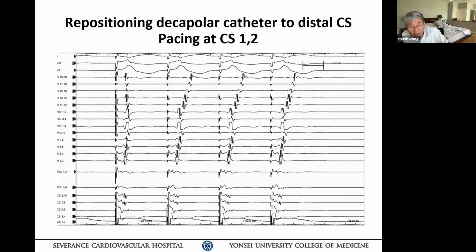But if you put your pacing catheter down to the cardiac vein, as you mentioned, it is epicardial. So I think that should favor pathway conduction. I shouldn't see any concern there because you're not going to alter the outcome or result of the pacing. Except I think you want to pace at very low output. The reason is you don't want to capture a wide area of the LV lateral wall because you're interested to know where the pathway is. So you don't want far-field capture or anything like that. You need to be careful. Just pace at as low an output as possible. That would give a more discrete, nicer electrogram. Okay.